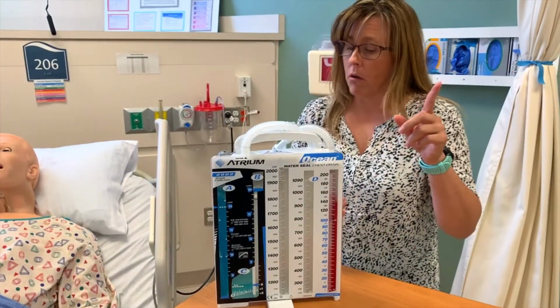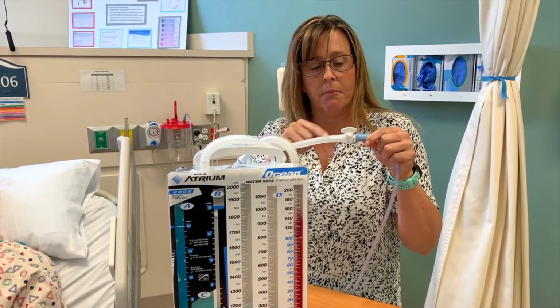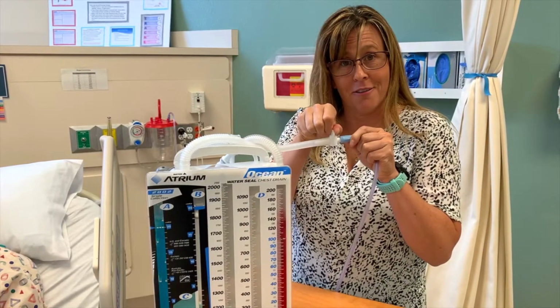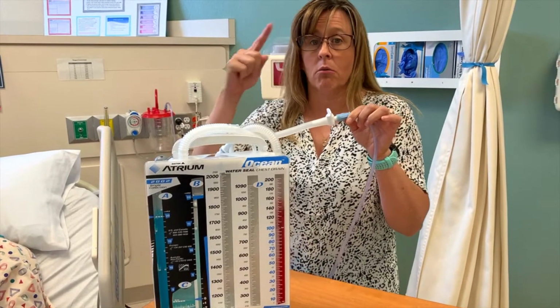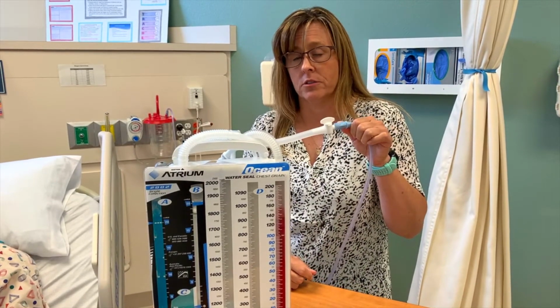Or remember what I told you at the very beginning, when you take your funnel and you fill everything up and you have to turn this to open the water back up, if you don't open it back up, guess what? You're not going to have any of that bubbling that you need to see. So, note to self: open it after you fill up your water seal.